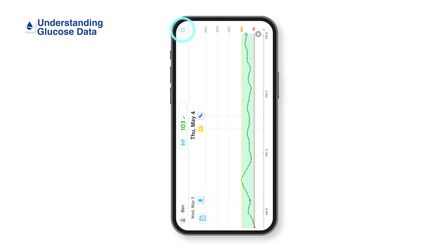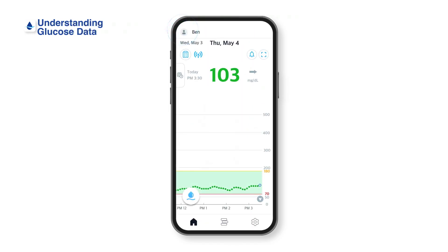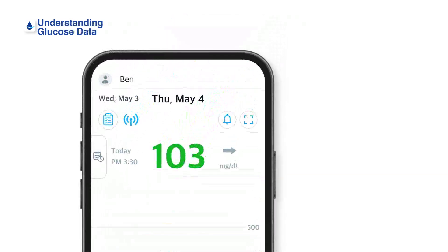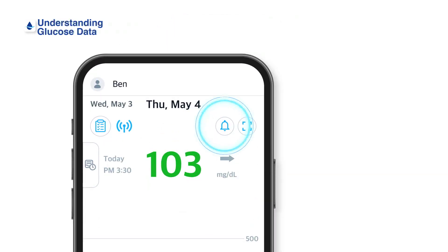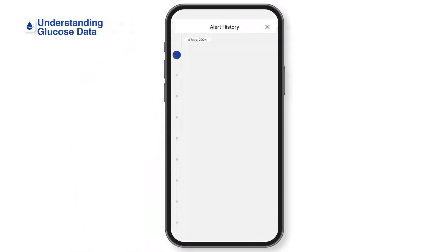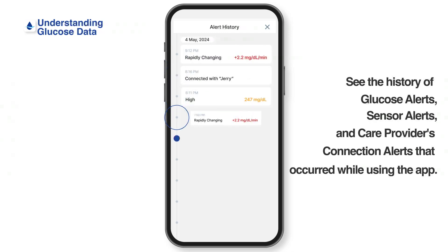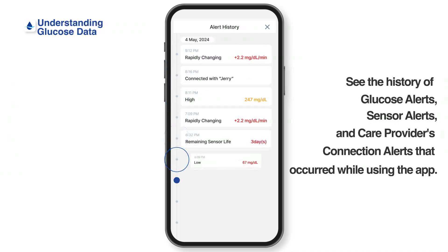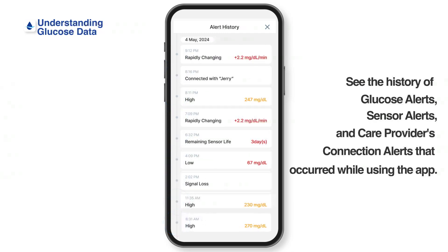You can find out more details on alerts by tapping the bell-shaped icon in the upper right corner of the home screen. You can see the history of glucose alerts, sensor alerts, and care provider connection alerts that occurred while using the app.